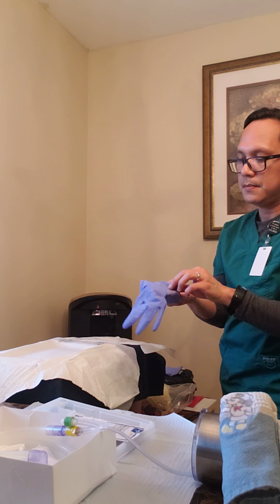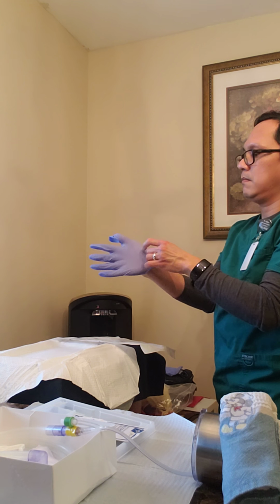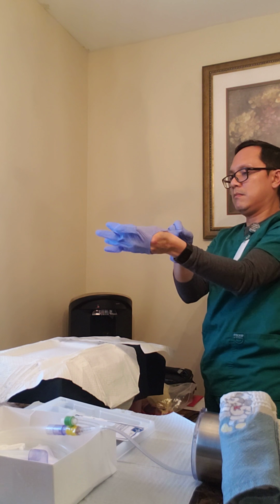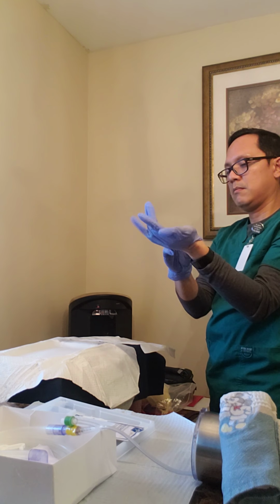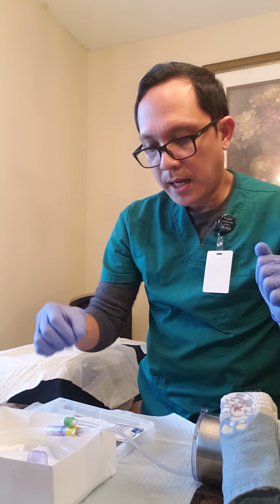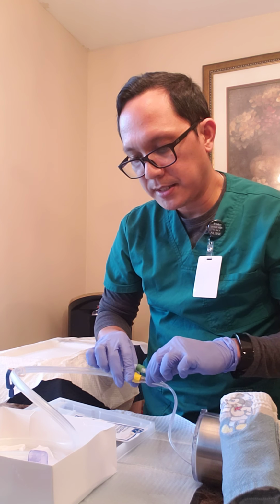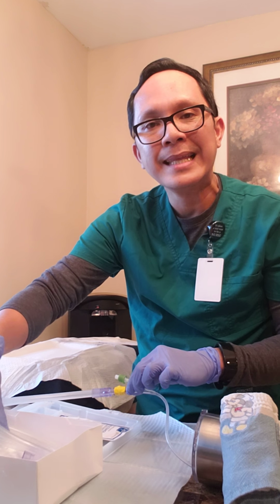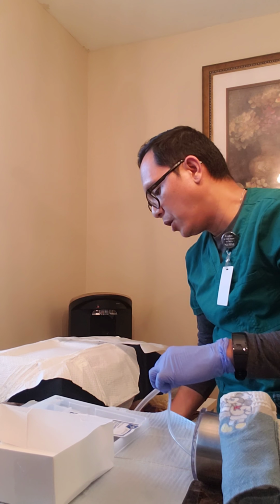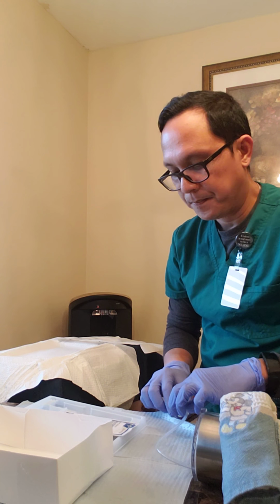I want to make sure I secure the Foley on my patient's thigh, so in case she moves, it doesn't get dislodged. I'm going to put the Foley bag below my patient's bladder on the side of the bed or on the railing of the bed.